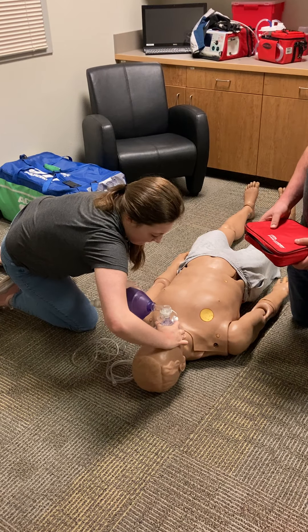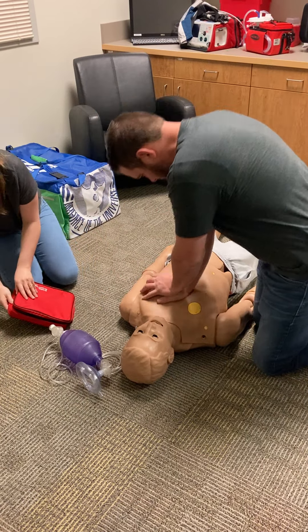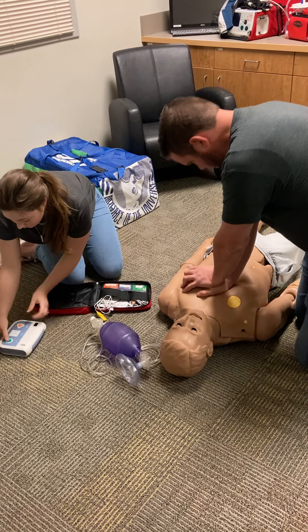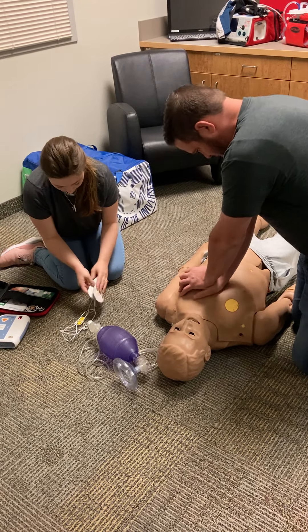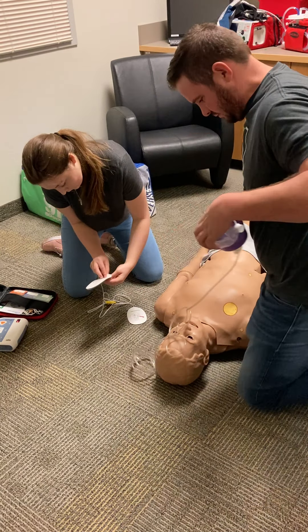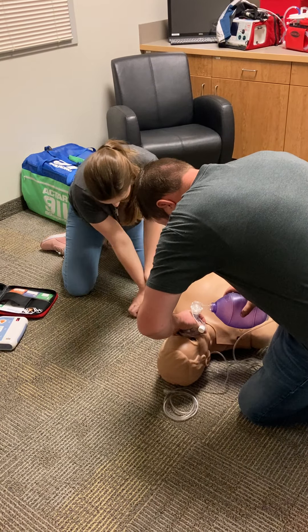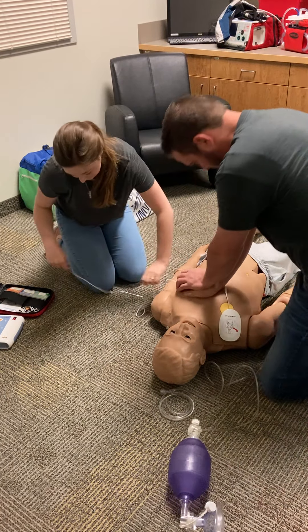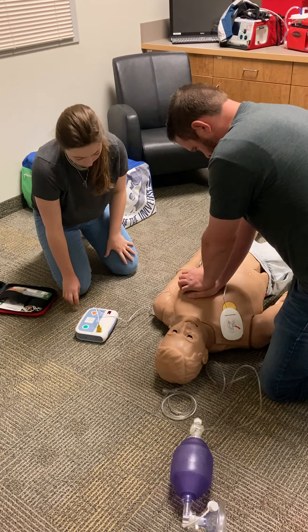Let's do it. 10, 11, 12, 13, 14, 15, 16, 17, 18, 19, 20.